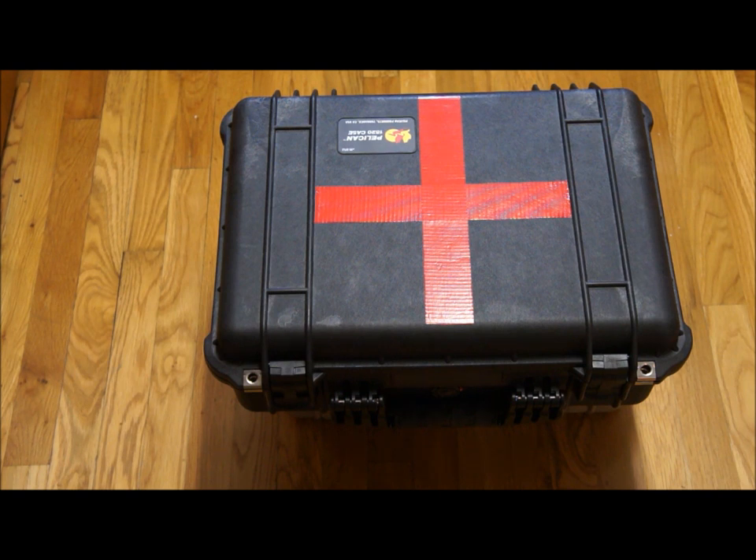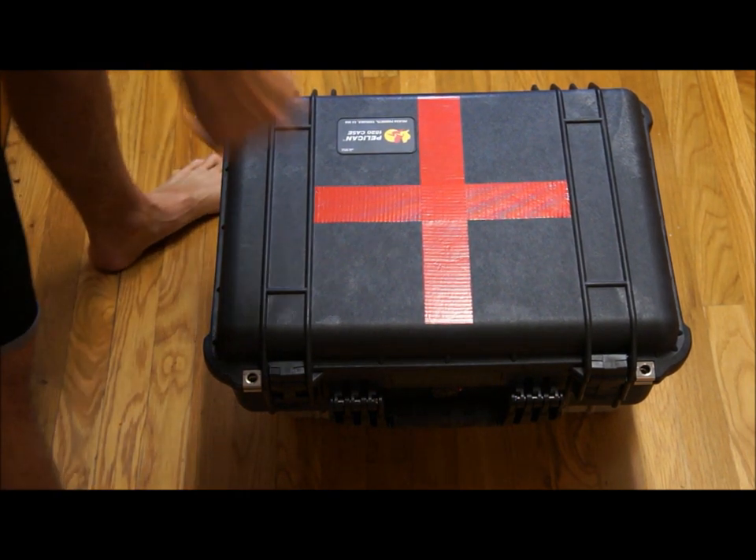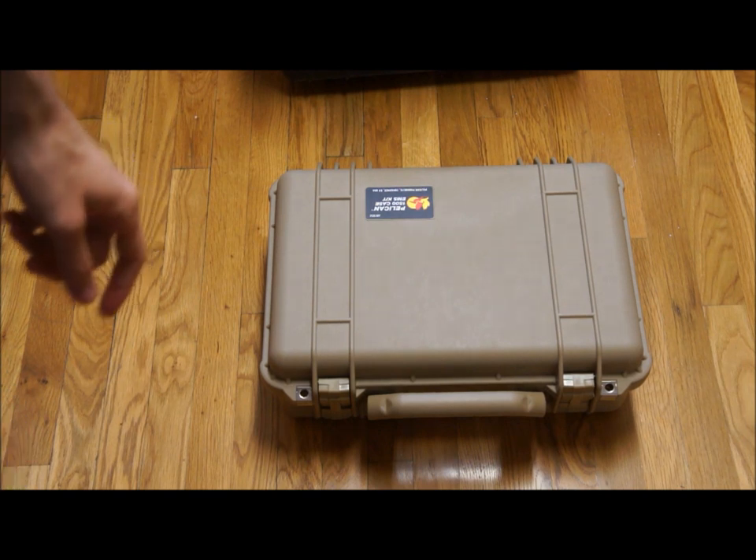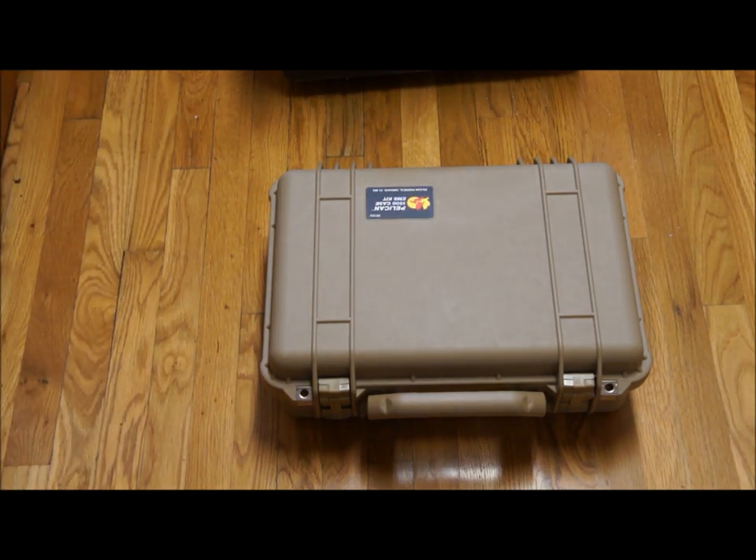So this is the Pelican 1520 that I was showing you all in the last video of my first aid kit build. After I started putting it together, I realized that was not going to work — I really disliked that case, it was too big, a lot of problems. So what I did is I went and purchased a new kit. This is the Pelican 1500 EMS, so it is designed for exactly what it's being used for. It's a very nice kit. I bought this one off Amazon; I think it was on sale for around $140. So this is the kit I'm using now.